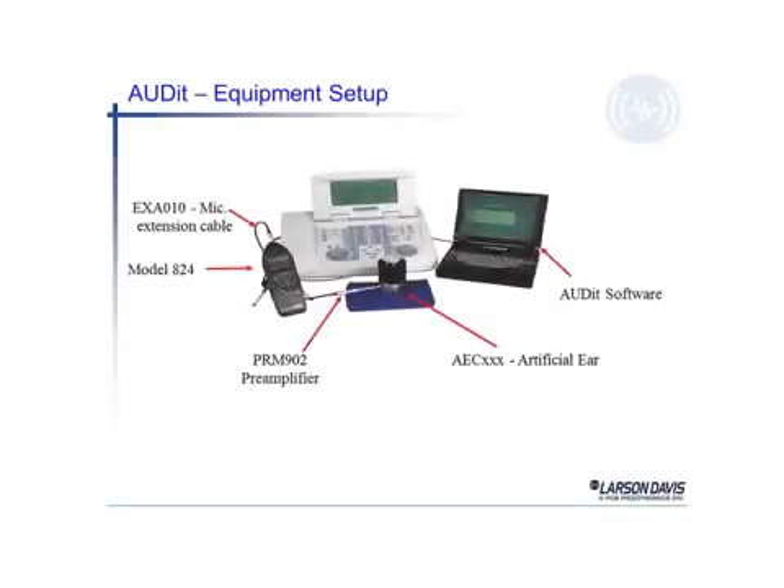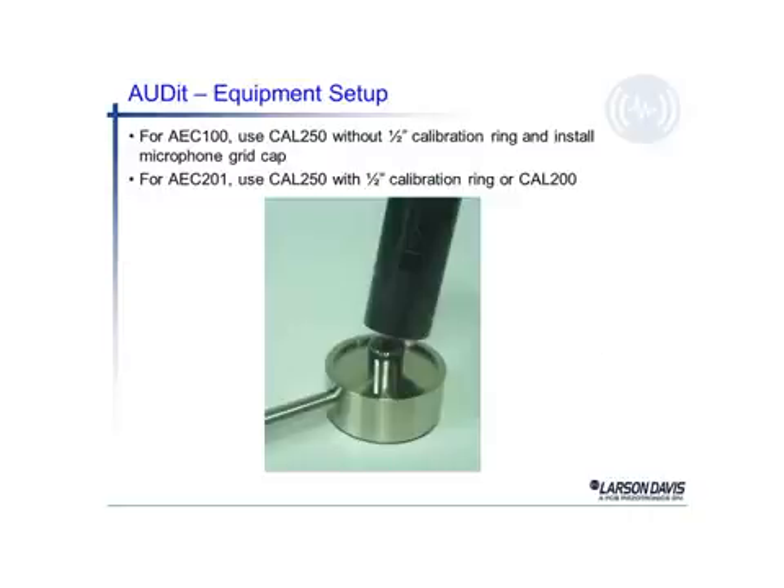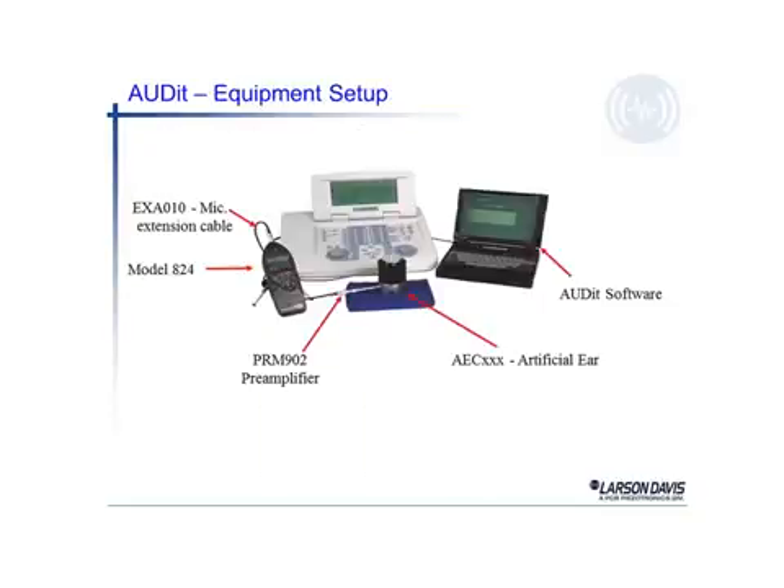The audit equipment is set up. You can see the audiometer in the background, the 824 sound level meters to the left. That is connected through an extension cable to the microphone pre-amplifier, which is then attached to the artificial ear. The actual earphone is inside the artificial ear, and in this picture it's not visible. We have a little black stand which allows us to hold the earphone in place, and the earphone is driven by the audiometer.